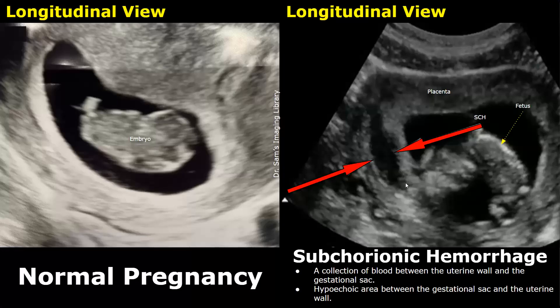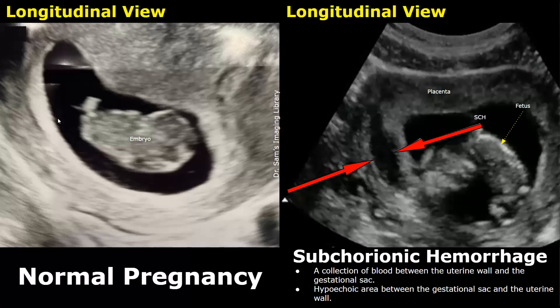This comparison is mainly based on abnormalities seen outside the gestational sac. In the left image, we can see a normal early pregnancy. The gestational sac is seen with a normal embryo. The boundaries of the gestational sac are smooth.